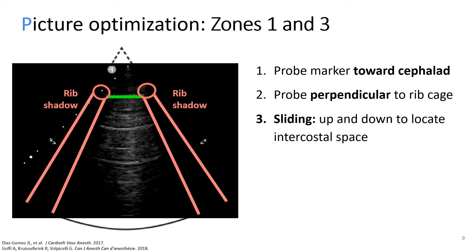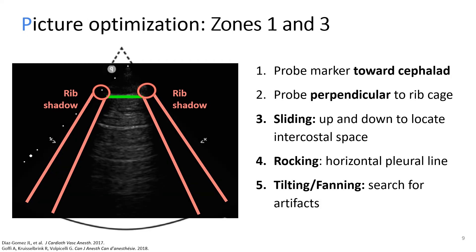Now that you're on the right spot, the next step is to make the pleural line horizontal. And you can do so by rocking your probe. This is very important. Keeping the pleural line horizontal enhances image acquisition and therefore the quality of your exam. And the last step is about searching for interesting findings, most of which will be artifacts. Tilting or fanning your probe back and forth will uncover important findings. Don't be shy in the tilting and fanning.